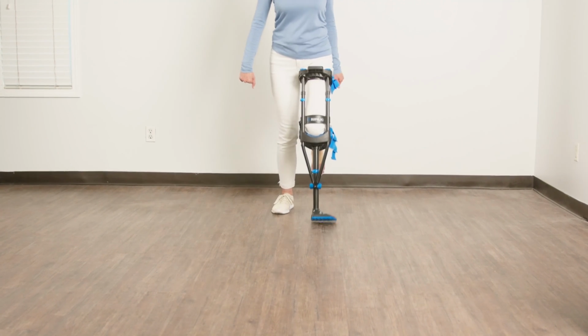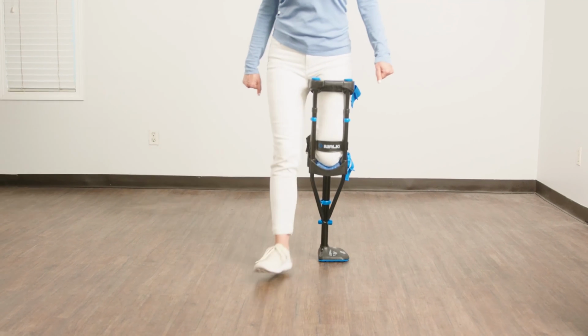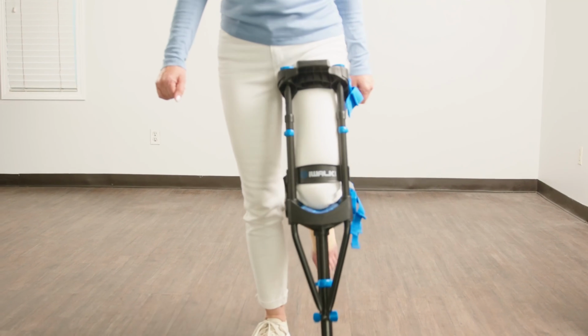At this point, you will adjust the crutch to provide equal leg length. This will improve the efficiency of the crutch and promote more normal gait. Also, check the strap tension and retighten if necessary.